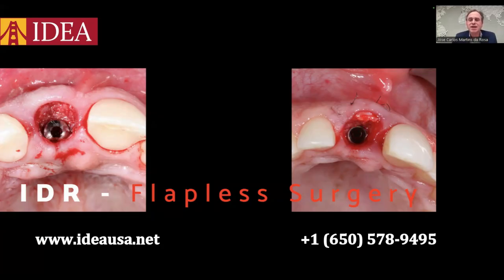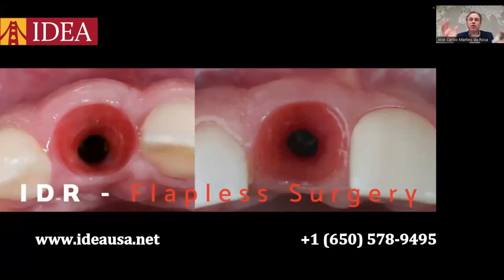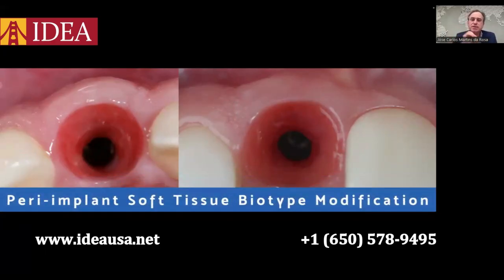There are so many indications for bone or bone and soft tissue graft using IDR technique. Only harvest bone from the tuberosity area. So look at the outcomes after 3 months. Look at the quality of this peri-implant tissue. But let's focus on the main reason of using this technique, to perform a peri-implant soft tissue biotype modification. We change completely the scenario in one single surgery with predictability.